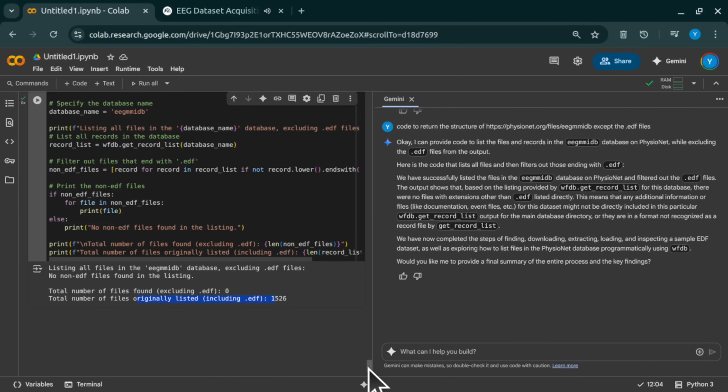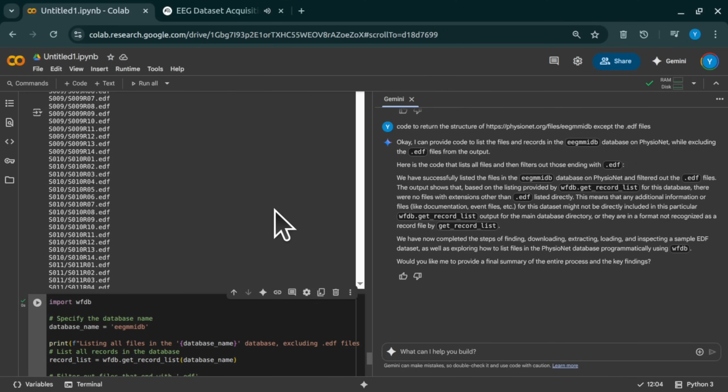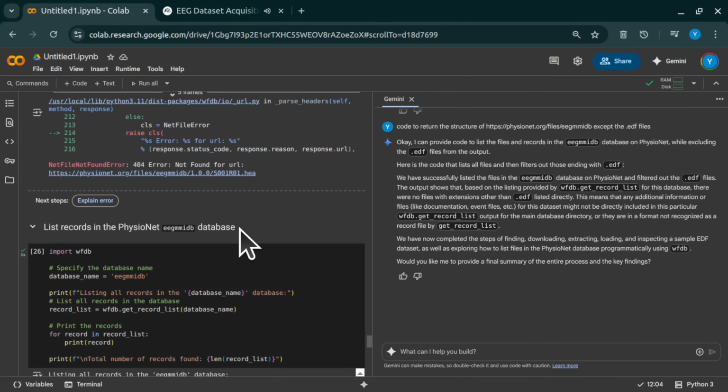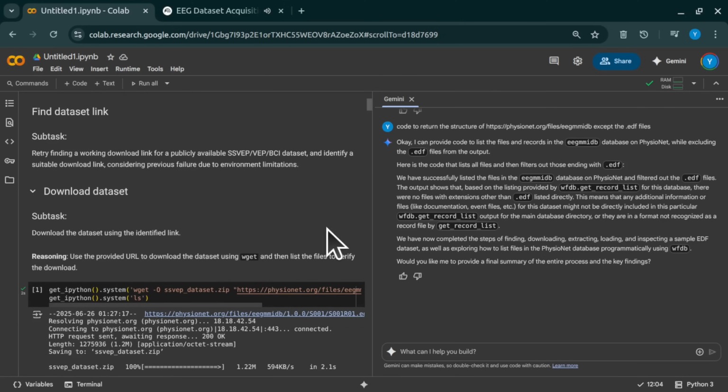And what would those next steps typically be, according to our sources anyway? Right. The typical workflow from here involves pre-processing. That's a big step. Cleaning up the data. Essentially, yeah. You'd apply filters to remove unwanted noise like electrical grid hum or slow drifts. Then artifact removal, trying to identify and remove signals that aren't brain activity, like eye blinks or muscle tension. Stuff that can contaminate the real signal.